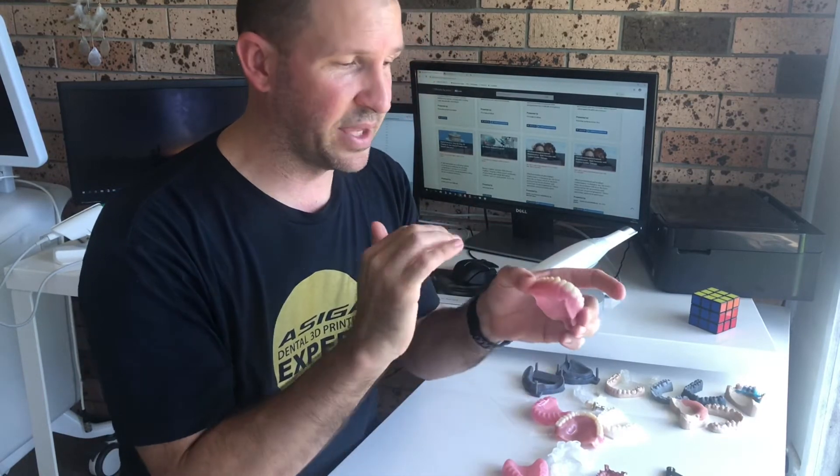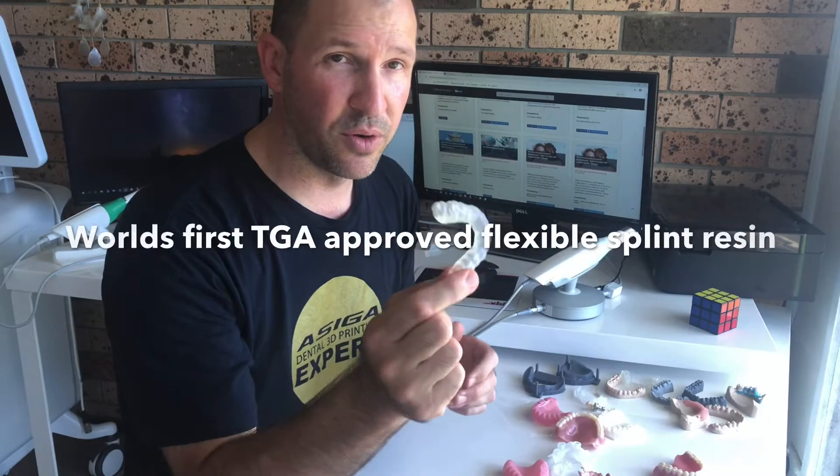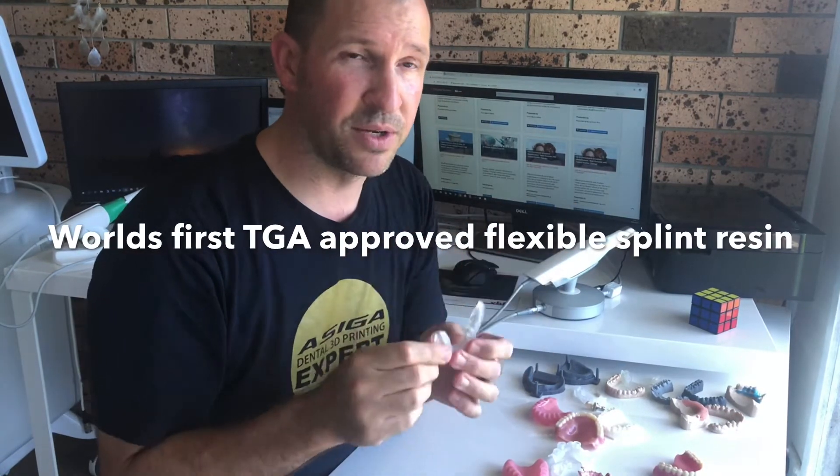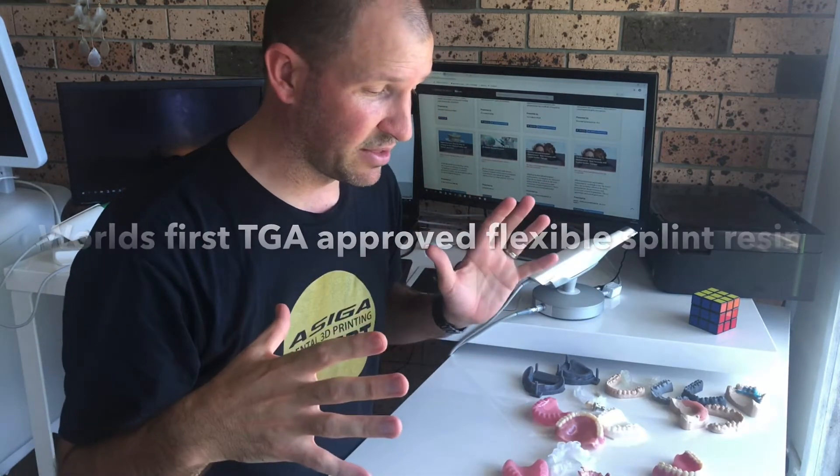Watching people design is one thing, but having actual TGA approval on materials is another. We now have the NextDent denture base material — TGA approved — with the NextDent printer. They've got five different tooth shades and five different denture base shades. Not only that, but this month we also received TGA approval on a flexible splint material, which is the world's first flexible 3D-printed material. Exciting times for this industry.